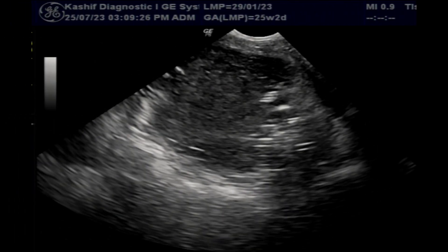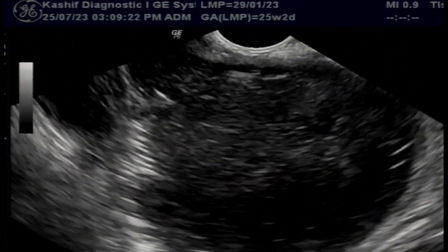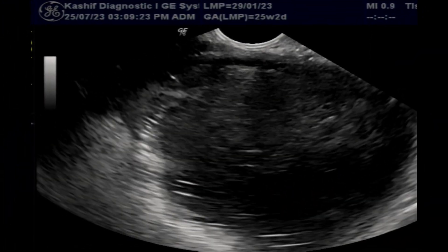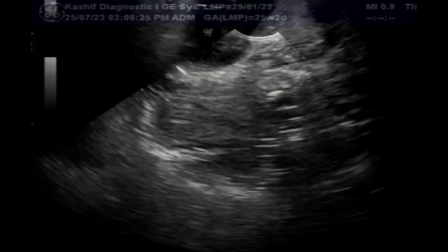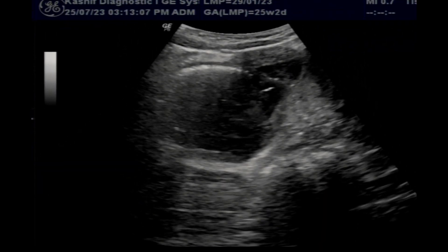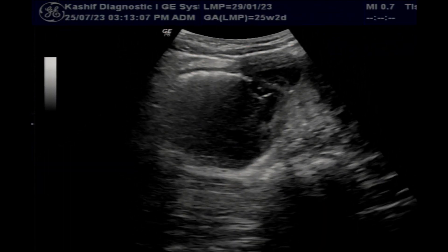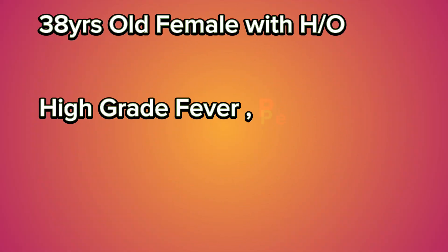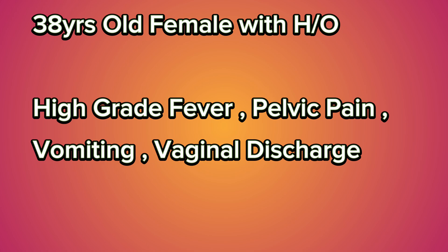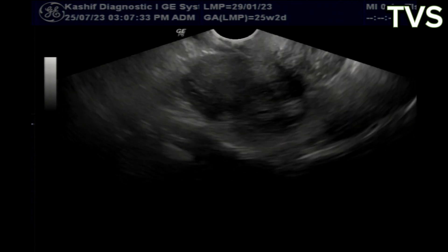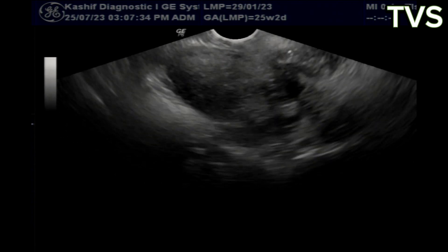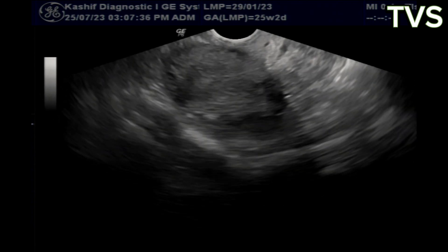This is a 38-year-old female with history of high grade fever, pelvic pain and vaginal discharge. She also gave history of DNC from a local clinic and vaginal discharge, smell and infection from 6 months.